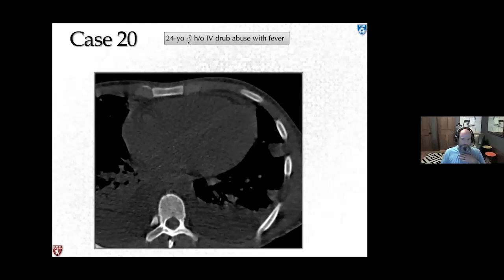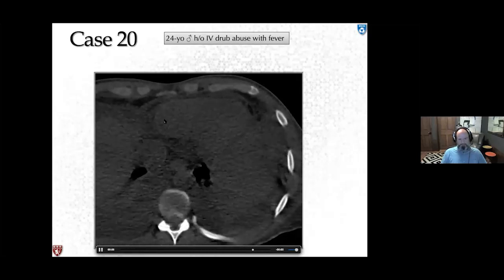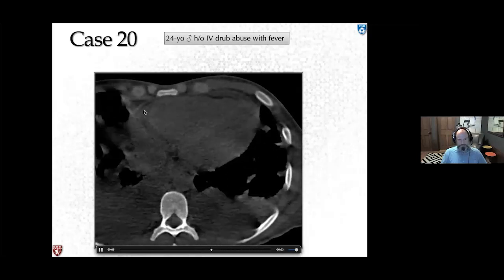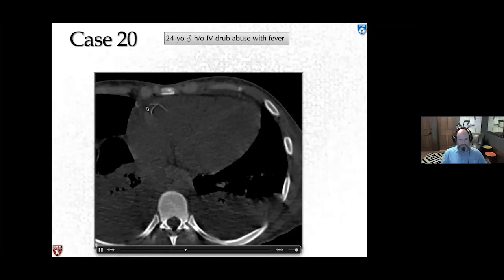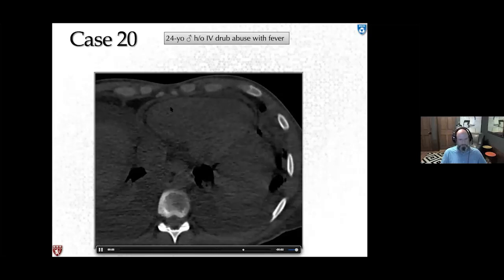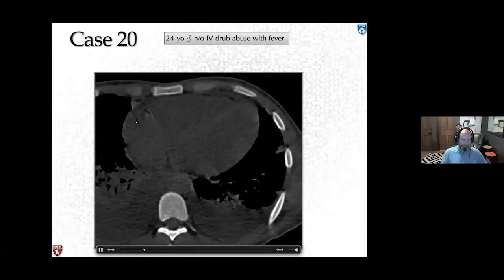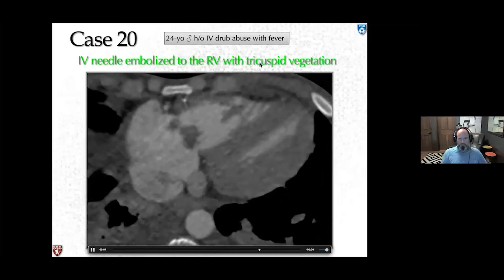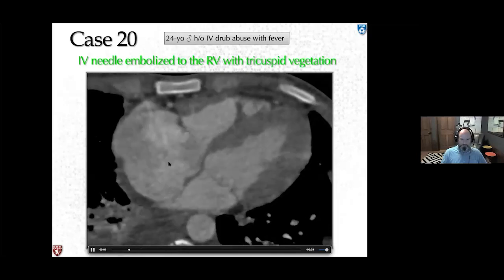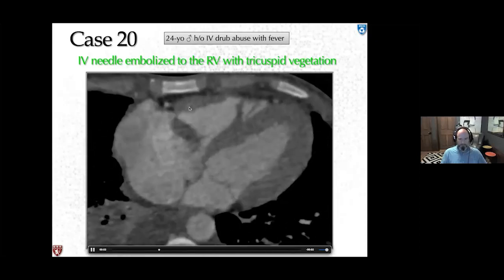Next case: a 24-year-old male with IV drug abuse and fever. Non-gated, non-contrast CT shows a hyperdensity with streak artifact in the right ventricle — appearing almost like coronary calcium on a non-gated study — but located in the ventricle rather than the expected position of the right coronary. This was an embolized needle buried in the RV free wall, accompanied by a large tricuspid vegetation.